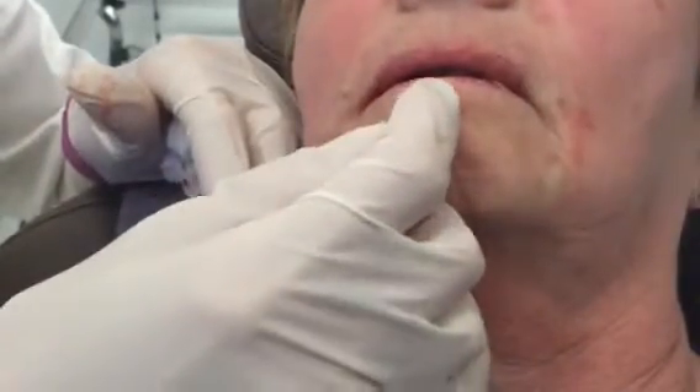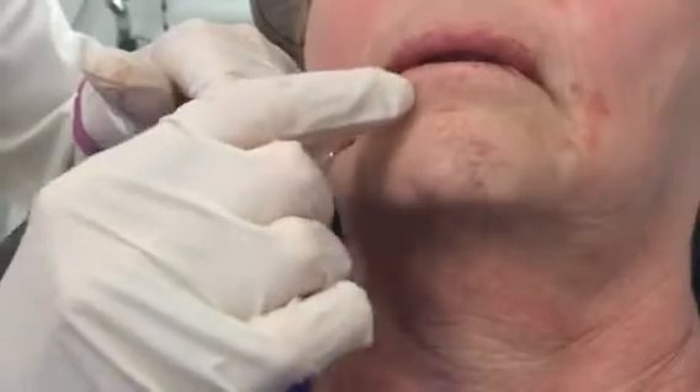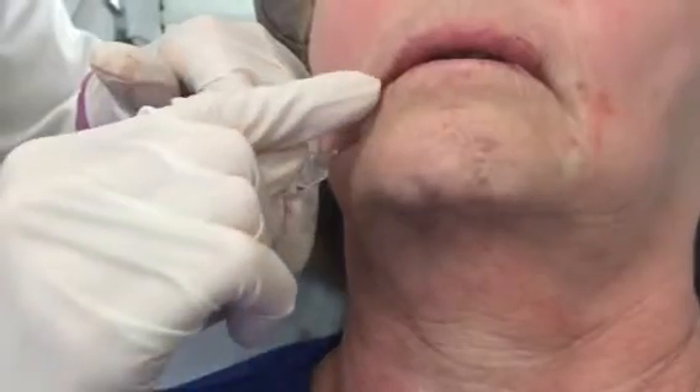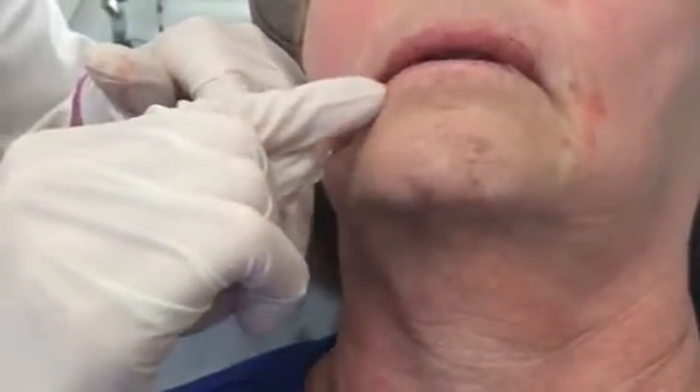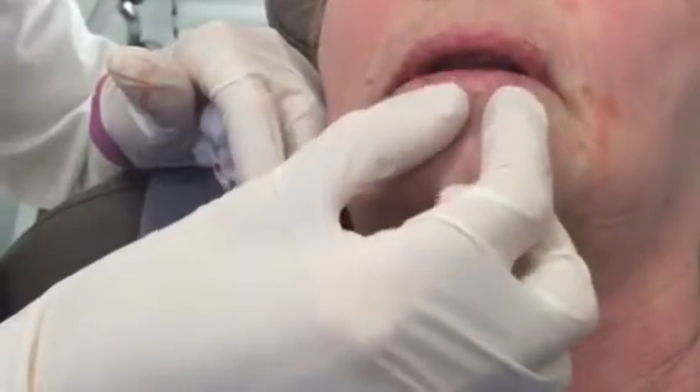It's already inserted and I'm going to be filling just a minute amount — like 1/20th of the syringe — just in this small area to give her some structure and support. And then finally, just to finish off, I'm going to go along the pink border and also finish up the actual red portion of the lip.